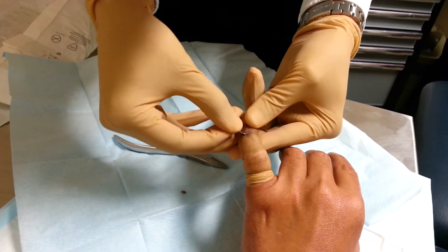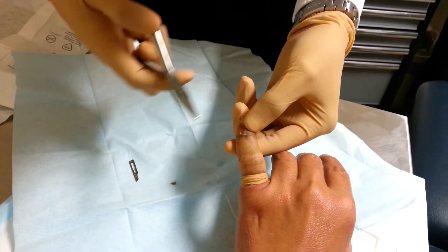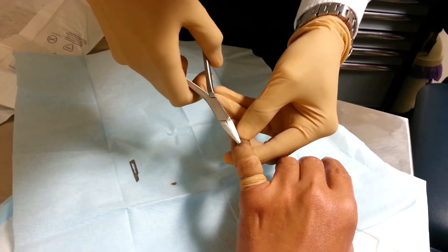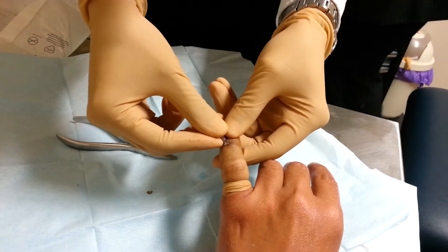He took a finger off — that's the door — don't put it back on there. Where's the other one? Up here. You want one? You'll want two, I can tell you — you want two. You put the tourniquet on, I think.